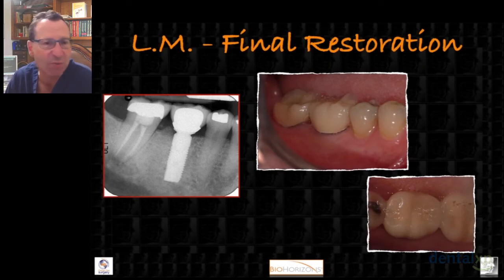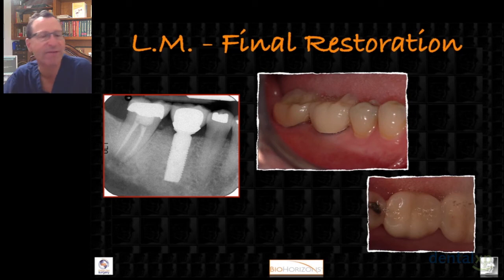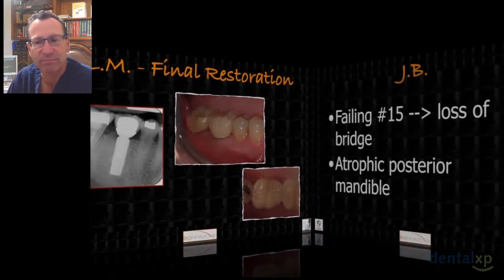This patient has no problem cleaning underneath there. It's got good contours. Aesthetically, it looks great. Functionally, it looks great. And years later, we still have good bone levels. In fact, you can see here the bone level actually rose a little bit above the collar of the implant.